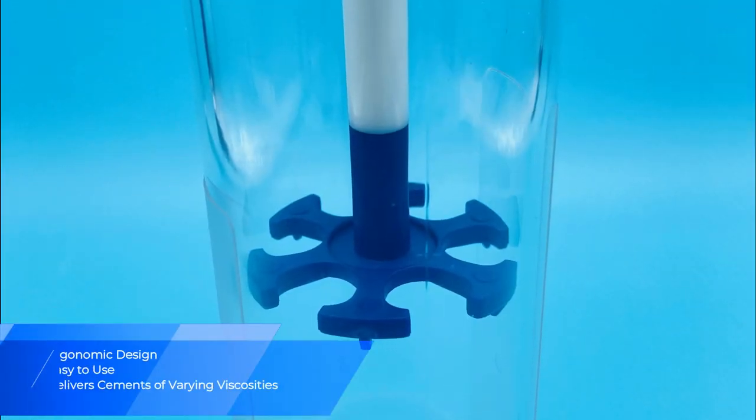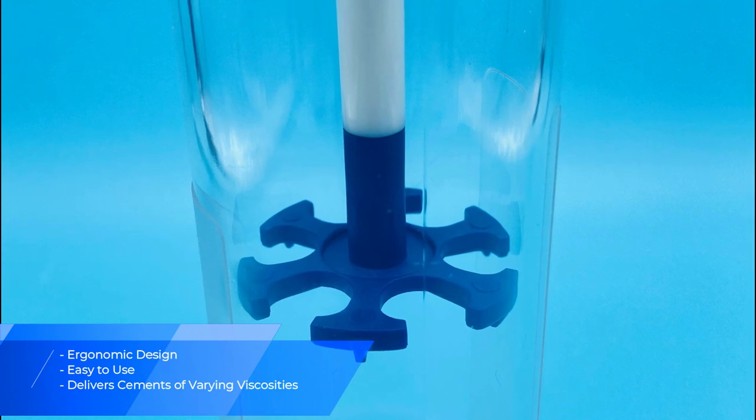It includes a simple, ergonomic and easy-to-use design capable of mixing and delivering cements of varying viscosities.